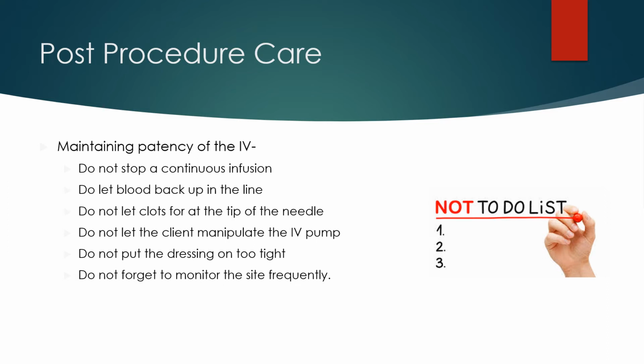We've talked about this, making sure we address the IV if it's not being infused. Do not let clots form at the tip of the needle. What this means is the IV is not connected to anything, and these are called saline-locked IVs. This is an expected thing to occur. To prevent this from happening, we're going to flush those IVs on a regular scheduled basis. Depending on your hospital facility, it may be flushed every 4 to 6 hours, but you should never let it go without flushing more than 8 hours. And that's going to keep those clots from forming at the tip of the catheter.